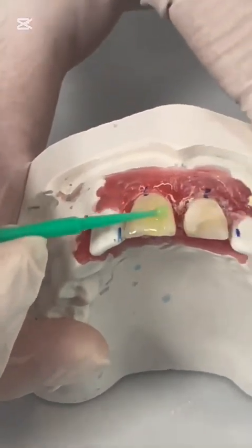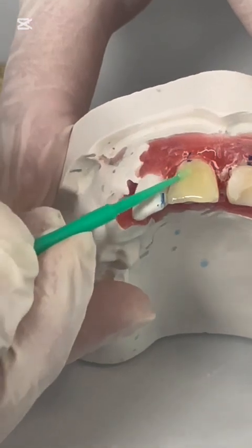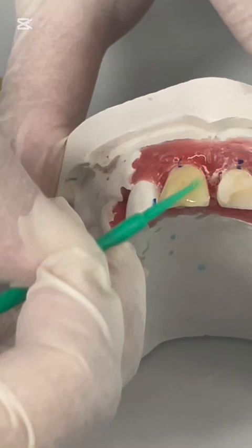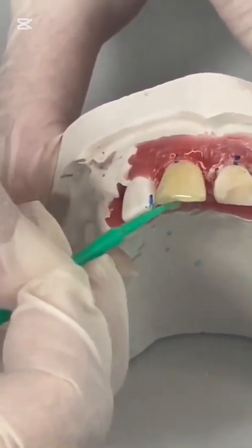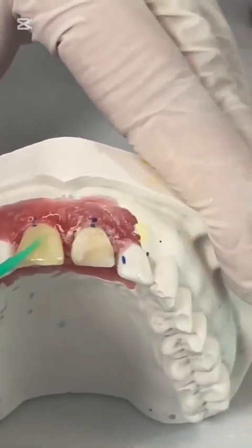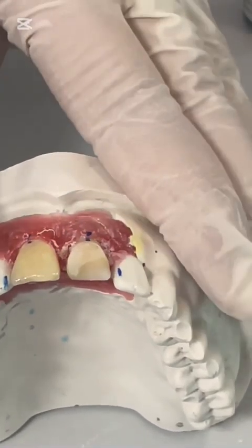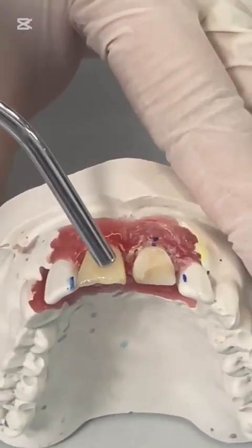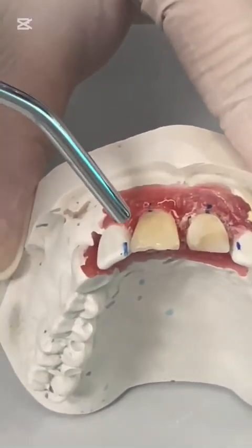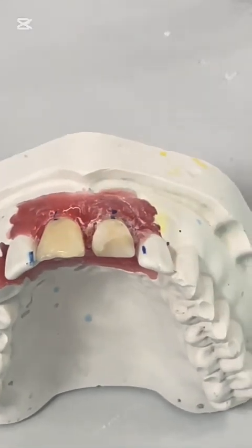Because this is self-etch adhesive, and in the self-etch adhesive we need to decrease the hydrolysis effect to the maximum. Okay, now light cure.